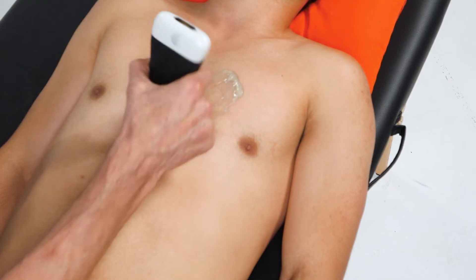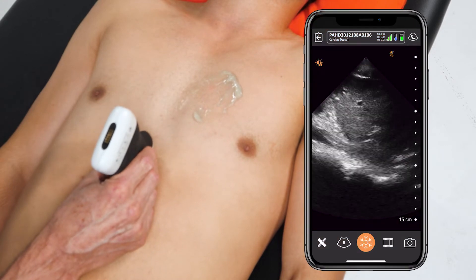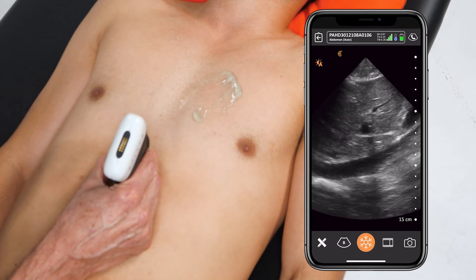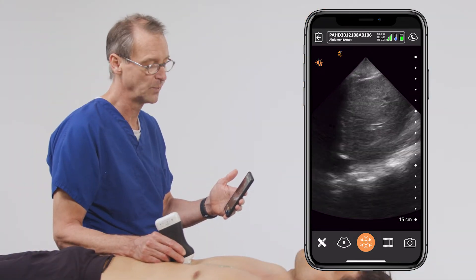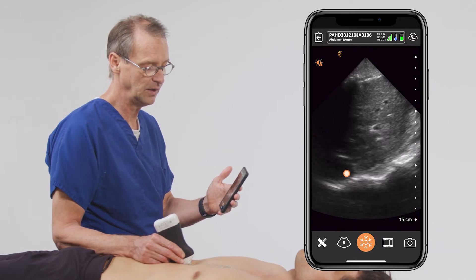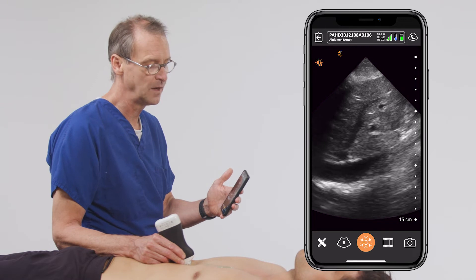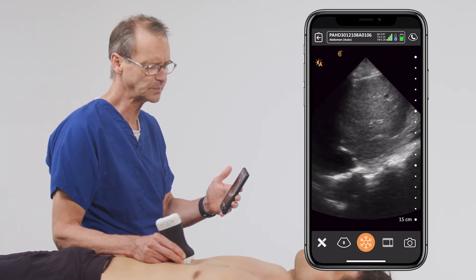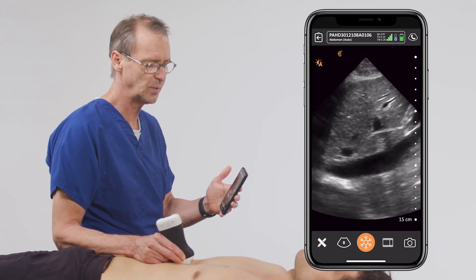The second part of the exam is to examine the inferior vena cava. In situations where patients have shock and hypotension, understanding the relative volume status of the patient is critical. By looking at the inferior vena cava, we can get a good estimate of the patient's volume status. There are two parameters we want to look at: the size of this vessel as well as its collapsibility.